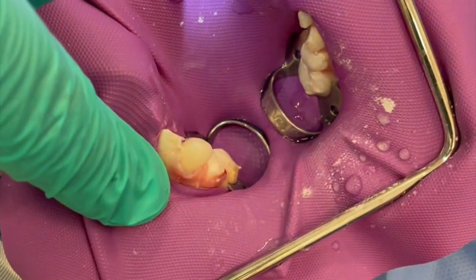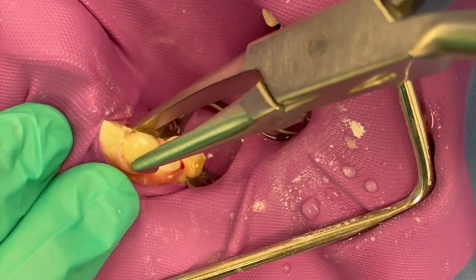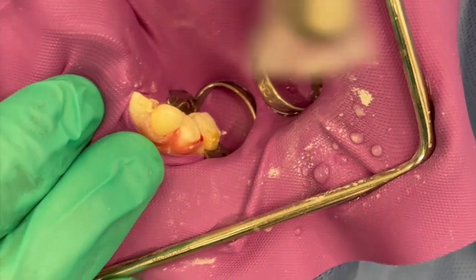We are going to take a strip crown off with a Howe plier. Place your Howe plier at the height of contour and rock back and forth until you feel the entire form release. The strip crown former should now be in your Howe plier.